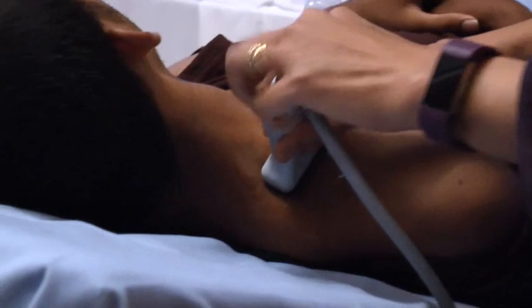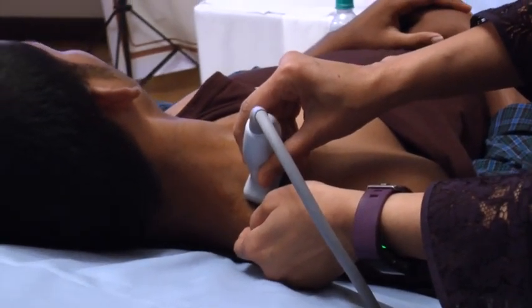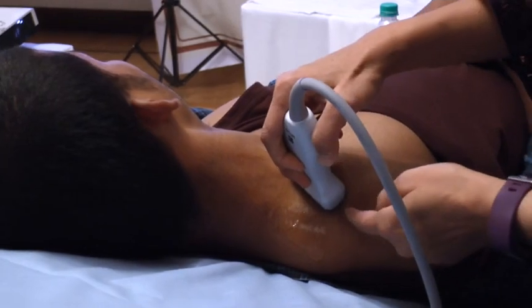There we go. And I think the needle comes from the posterior aspect, just at the anterior border of the trapezius muscle here, and I feel it's a little bit safer because you're far away from the dome of the pleura with this approach. Rather than the lateral approach, where you're quite close.